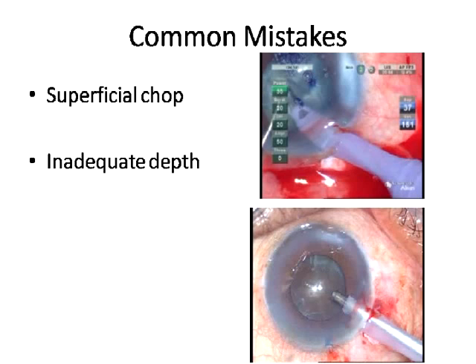Even experienced choppers sometimes fail to execute a good chop when not in adequate depth. For a grade 4 nucleus, you need to be as deep as possible in the nuclear core. If the nucleus is rotating instead of being chopped, turn it around, create a crater in the middle, get deeper into the nuclear core, take a good hold. You should see the entire nucleus moving along with the Faco probe — a lollipop effect — and then execute the chop.